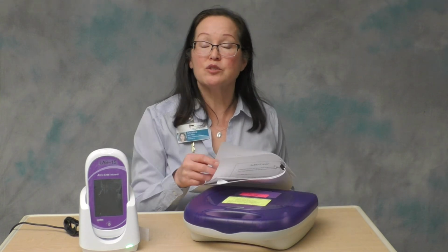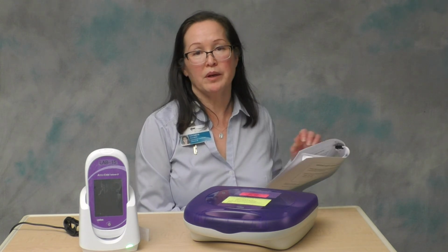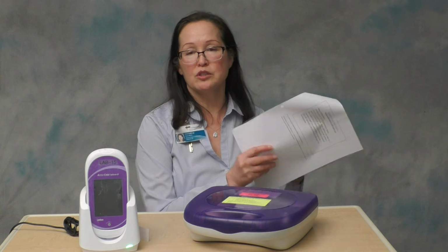Again, I went over the comments, so once you get your patient test result, you can attach a comment if you need to. Use procedure error comment if you want to keep it out of the patient's chart, and the other comments are not required, but you can just use it to communicate with someone. So now I'm going to demonstrate running a patient test.